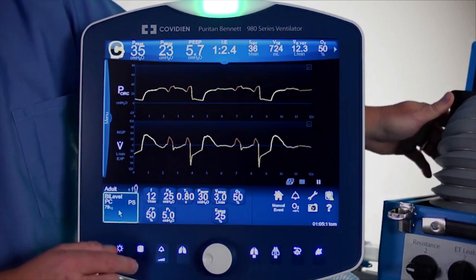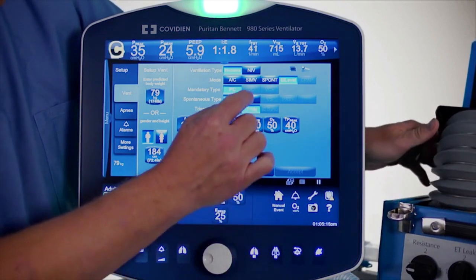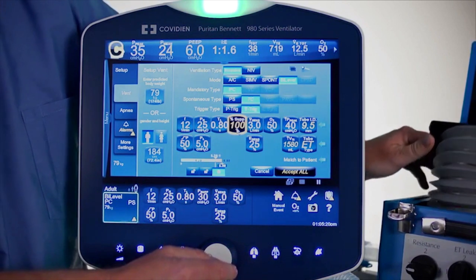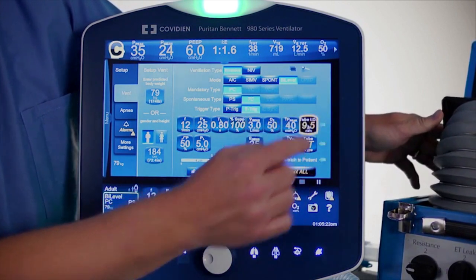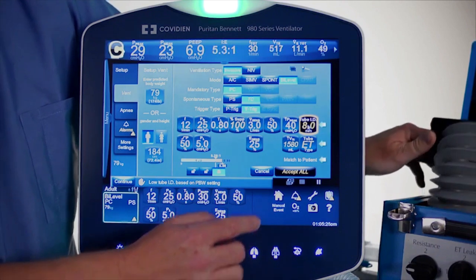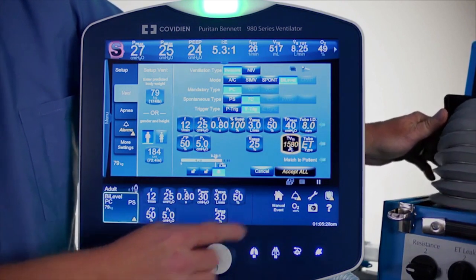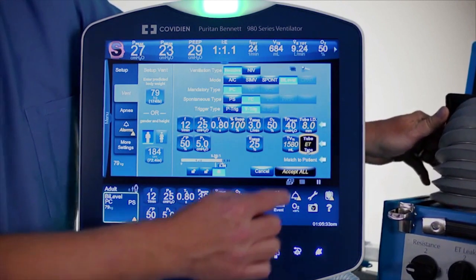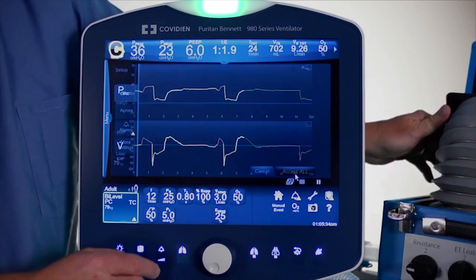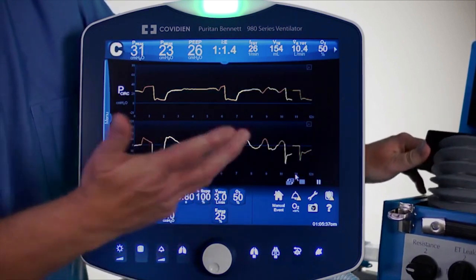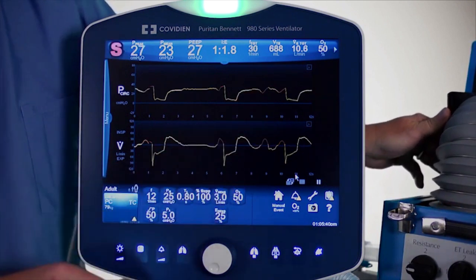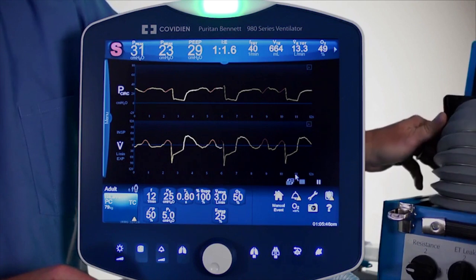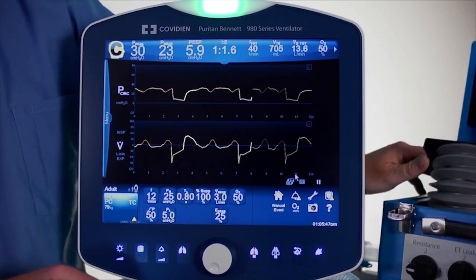Tube compensation can also be turned on. Going over and switching to TC, you can set the percentage of support from a tube compensation standpoint. You must select the inner diameter of the endotracheal tube. There is a high inspired total volume alarm limit, as well as the type of artificial airway — ET tube or trach tube. Now instead of pressure support being 5 or 10 centimeters, you're getting whatever is needed to overcome the imposed work from the artificial airway. These are a couple of adjuncts to adjust the bi-level software.